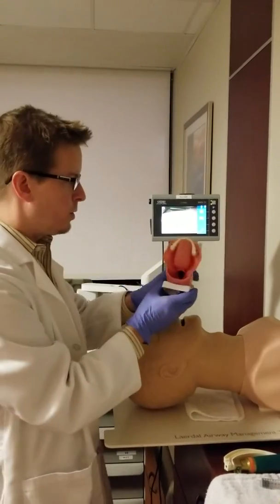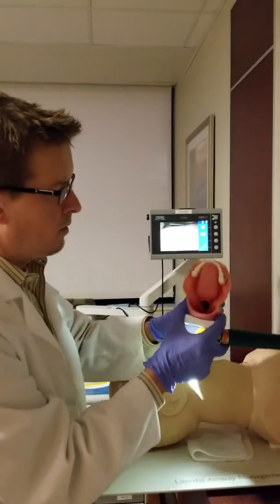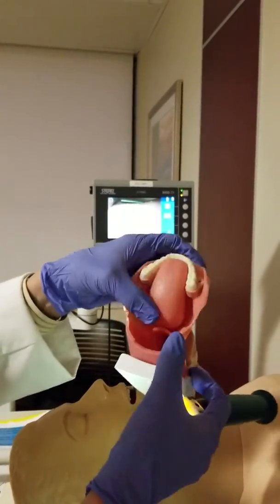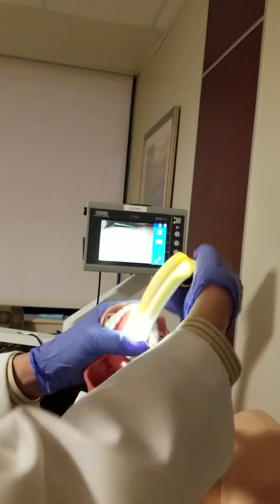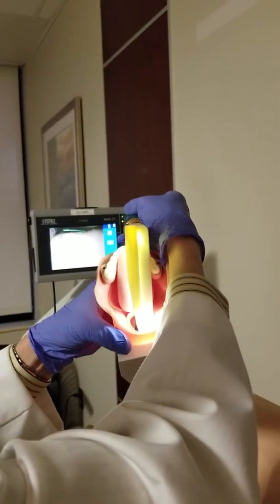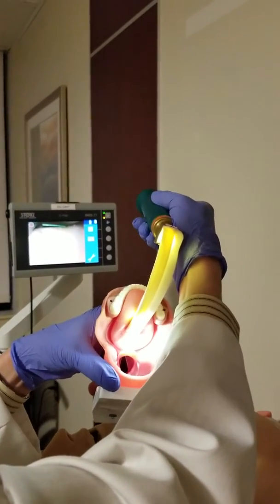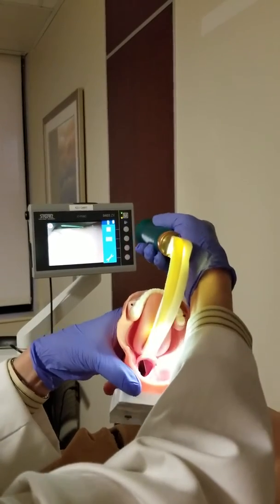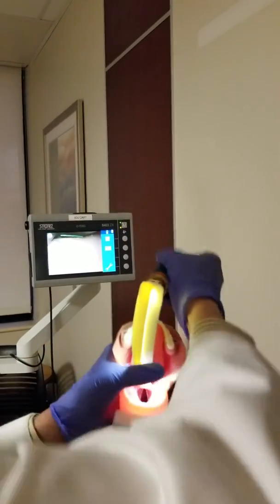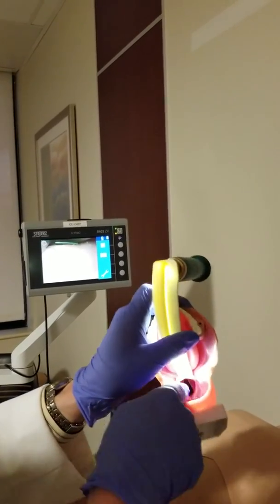First, before we start, I want to review what the vallecula is and why it's important. The vallecula is right at the base of the tongue, where the tongue connects right above the epiglottis. When you're using a Macintosh blade, the biggest mistake I usually see is when people dive bomb to bury the blade and then they're looking, but you're actually covering up things that you need. What I like to do is advance and lift so I can see my landmarks. See how I can see where the blade needs to go now? It needs to go right at the base of the tongue, and when you get it there and you lift upward — never back, always away from you and up — it'll lift that epiglottis right there, and that's where we want to go.